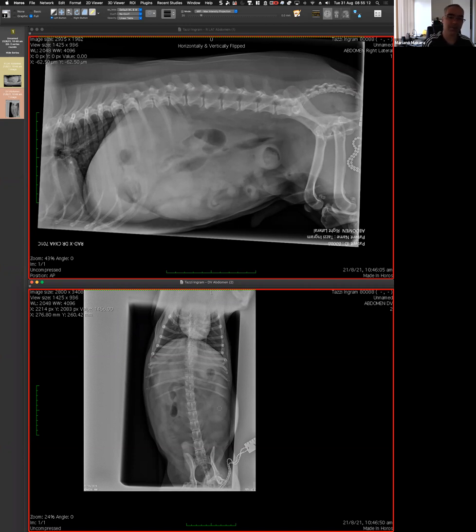And that's probably, I mean, people working in the clinic may realize and may also be a bit upset with imaging people that we change our mind. One thing is looking at a CT as it comes, and that is basically dealing with the problem. Makes sense? So this vomiting dog or a dog with a mass, and this is what we see. And then we have a very different approach when we go to our office. We sit down, we try to find more evidence, we try to put everything together, and we try to go in detail to very unimportant or peripheral things.